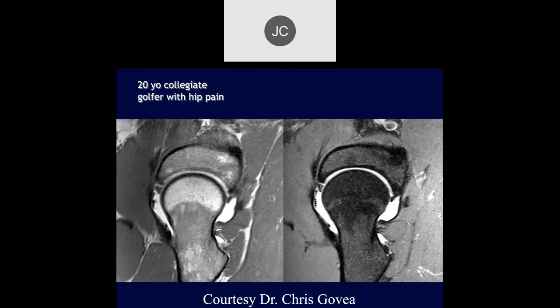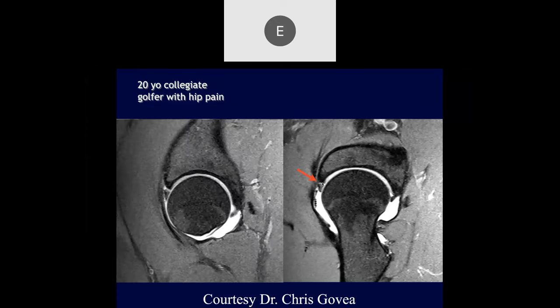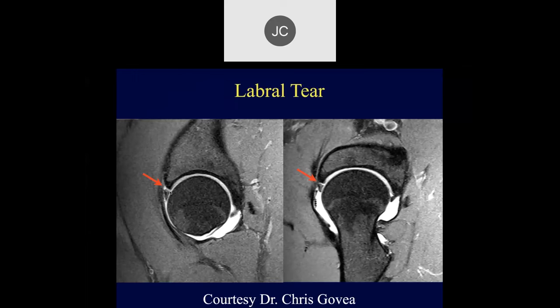20-year-old collegiate golfer with hip pain. This is an arthrogram. Looking at that anterior labrum, I see contrast going through the base — I'd call that a tear. On the sagittal images, we can see it goes to the anterior labrum as well. This was a labral tear.